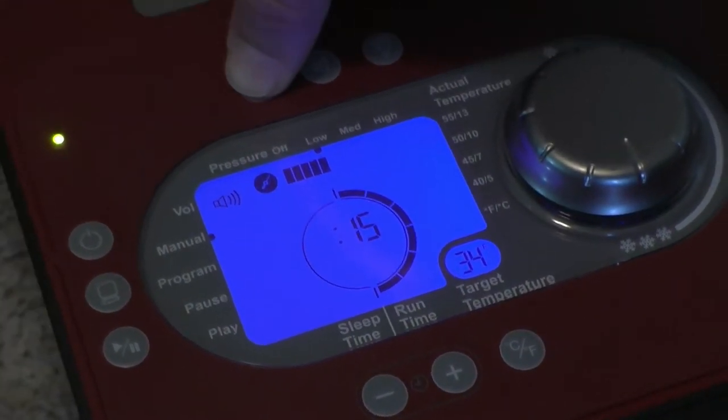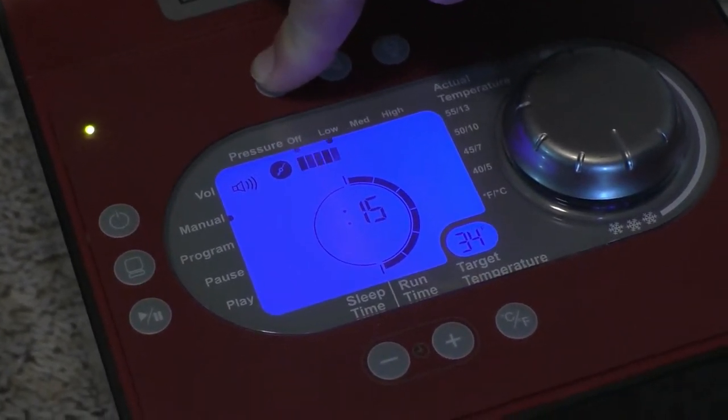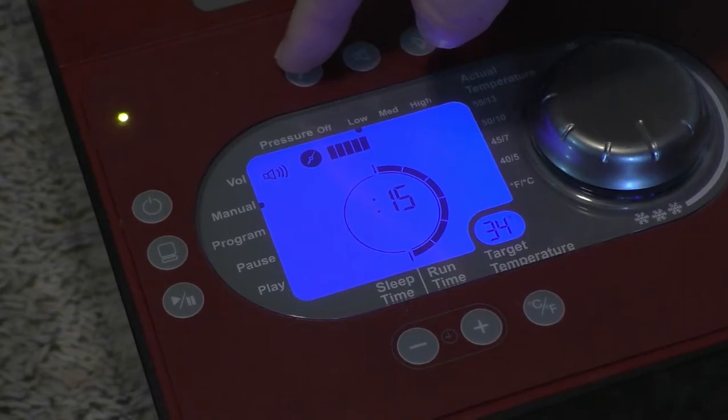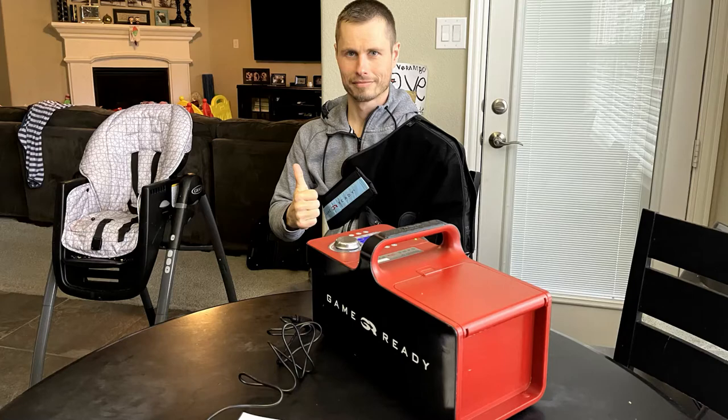The top left button controls the pressure in the machine. It is automatically set to low, but if you press it you can go medium, high, or turn it off. After all that, just press play and you are good to go.